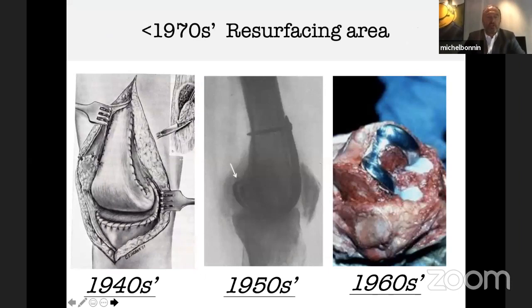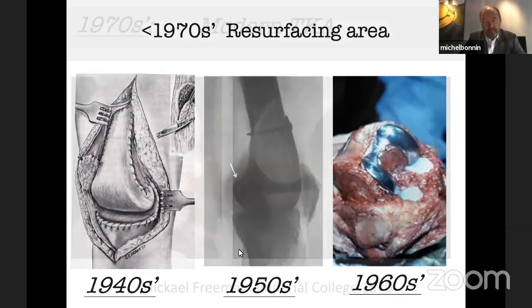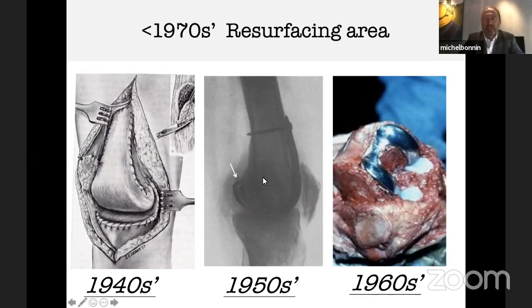The first half of the 20th century was the era of resurfacing. Up to the 40s, the resurfacing was made with soft tissue, mainly iliotibial band or surrounding tissue of the knee, which had quite good outcomes finally. In the 50s, after the discovery of chromium cobalt, called at that time Vitallium, it was a hard metal era in which the surgeon was resurfacing the distal femur with metal. Then in the 60s, it was still a resurfacing on the femur with polyethylene on the tibia. But all that period was purely resurfacing. There were no bone cuts, and we tried to reproduce the native anatomy of the knee.